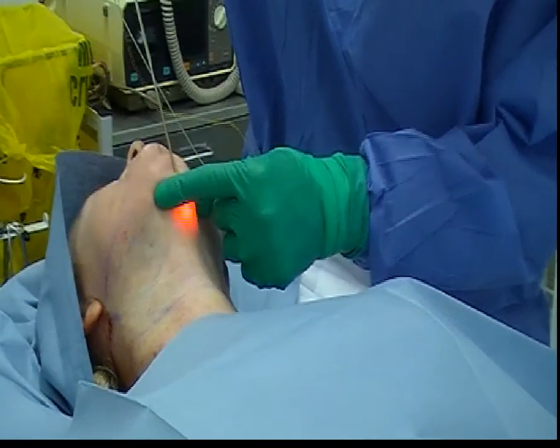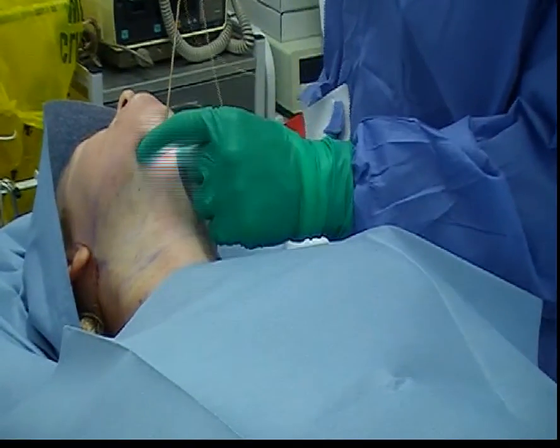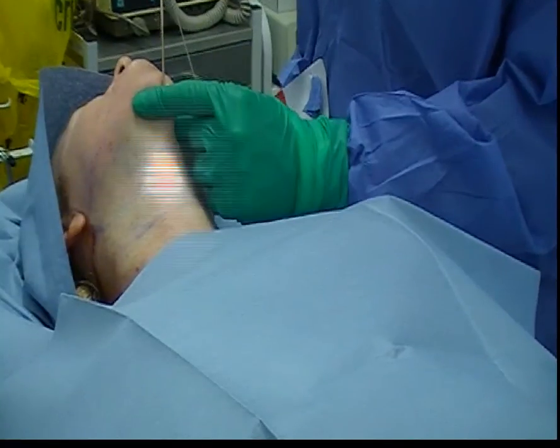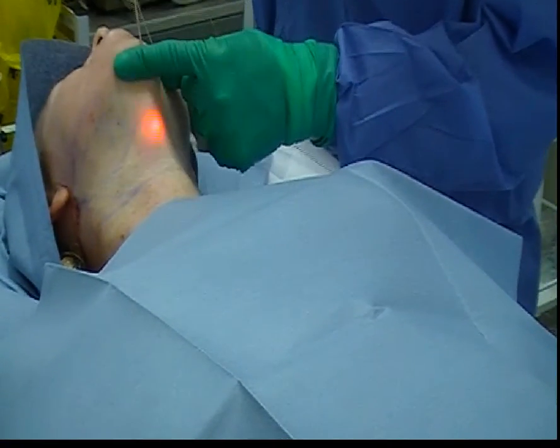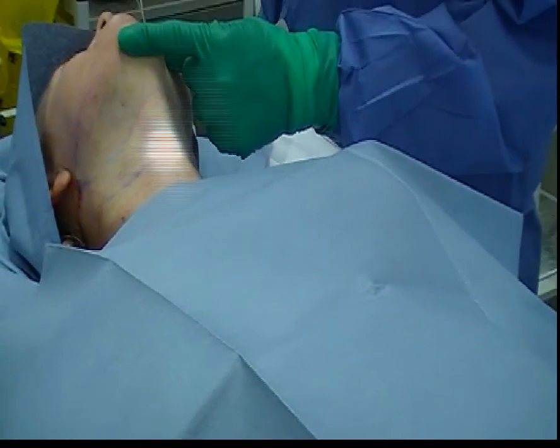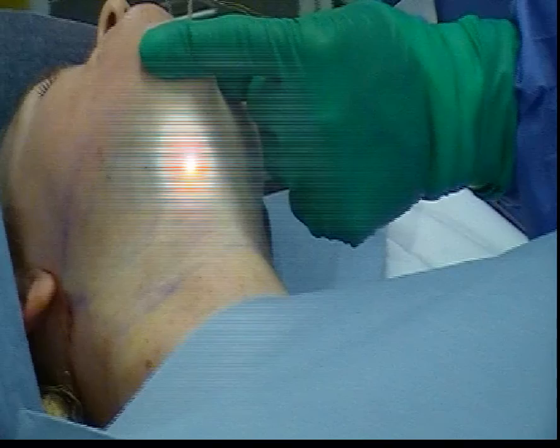Now we're delivering another 2,000 joules into the center of the neck, again in a fan-like fashion, varying the length of the strokes. The temperature build-up occurs at the base of the neck as the heat radiates inferiorly. So if you're going to get a blister, it will occur at the base of the neck.